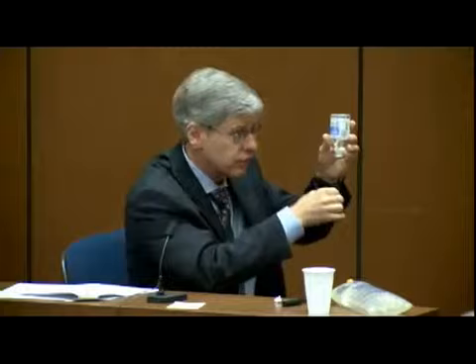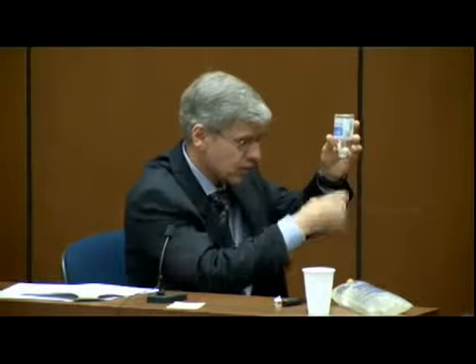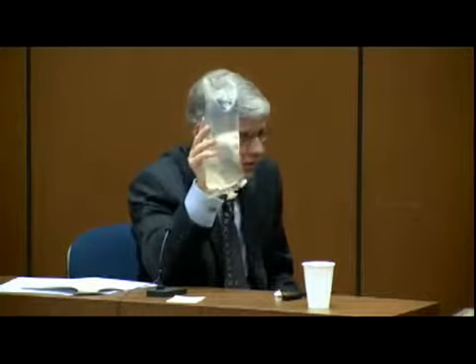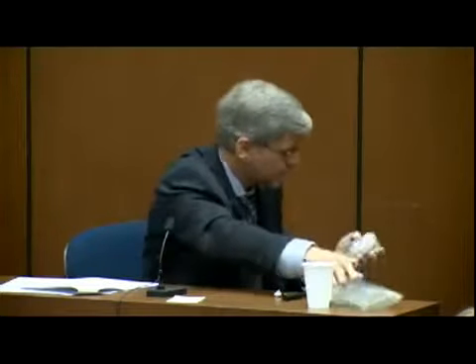You can either go through it with a small needle to draw a drug into a syringe, or, as has been done in this case, one can go through it with a large spike, as I described, and you can remove it with an infusion as a drip. So a spike would go into this, and that would go to a drip chamber, and drug would drip out of this. The one key thing to point out, though, when the saline comes out of this bag, the bag just shrinks. It gets smaller. There's no problem. This doesn't change shape. It's glass.